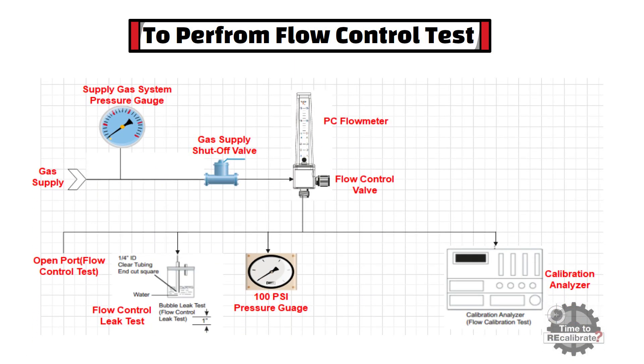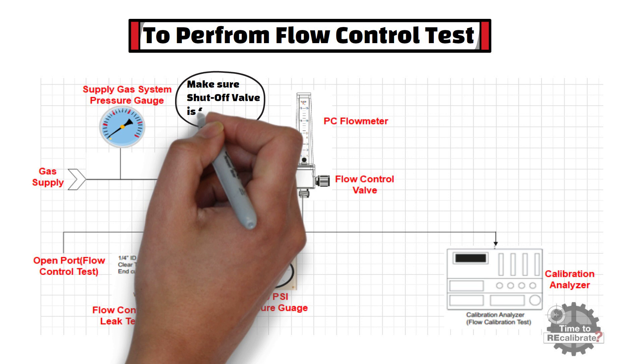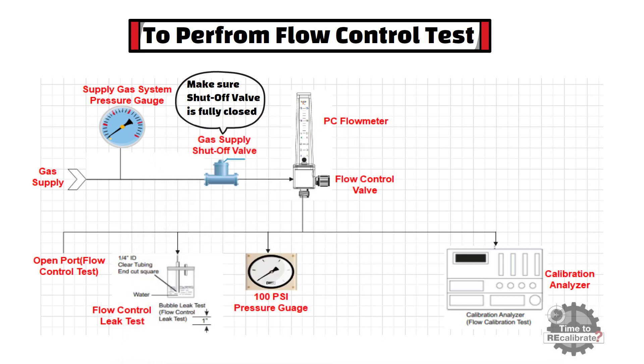In this section, I am going to show how to perform the flow control test for an oxygen flow meter. To perform the flow control test, first close the shutoff valve and make sure it is fully closed. Then turn off the flow control valve of the oxygen flow meter by rotating the valve clockwise. After this, open the gas supply shutoff valve and slowly open the flow control valve by rotating the flow control knob counterclockwise. The ball should rise immediately after valve rotation is begun and rise steadily with continued counterclockwise rotation.